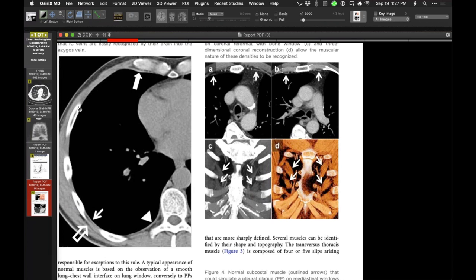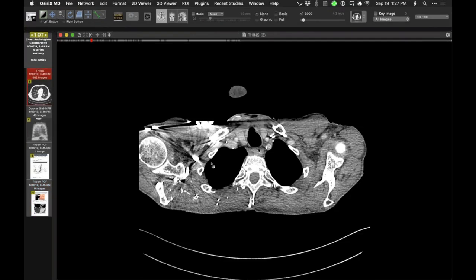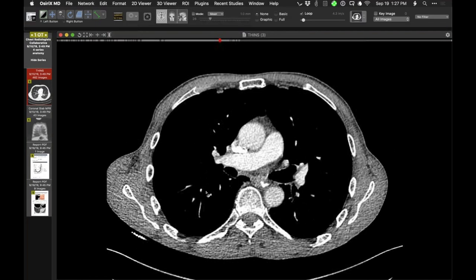So Howard, the picture on the left here, I've seen that quite a number of times, and it's always when I'm looking for plaque. So if it's nice and symmetrical up there, I will blow that off and it doesn't really protrude into lung. But I've never seen what you showed to begin this case, where it really seems to be set on a little pedicle almost. Kind of curious.